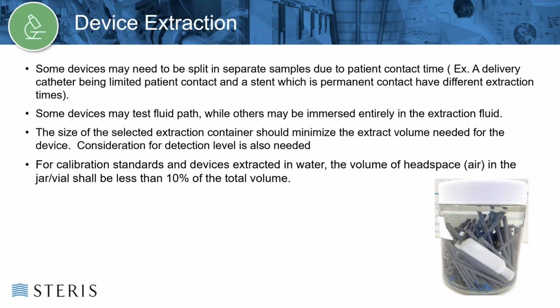Ethylene oxide residual testing is normally performed during sterilization validation activities. Samples are pulled from the sterilization load after a minimum amount of aeration. The samples are frozen to prevent off-gassing during storage and shipping. A sample blank, which is non-processed, is tested to ensure no interfering chemicals in the product extraction are affecting the measurement of EO and ECH.